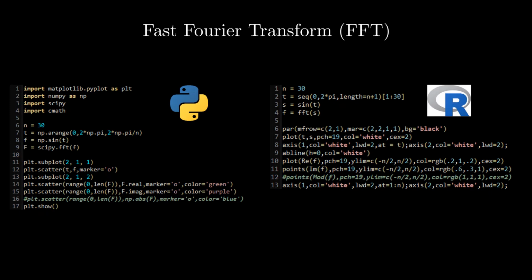If you're interested in getting some real-life Fourier transform practice, you can play around with the fast Fourier transform, or FFT as it's known, which is an algorithm that computes discrete Fourier transforms very quickly. It's no exaggeration to say that the FFT was a technological game changer that today exists in nearly every electronic device in some way. As a quick example, let's run an FFT together and see what it looks like. Here's some code you can use. Python on the left, R on the right. Both R and Python are free coding platforms that I use a lot.